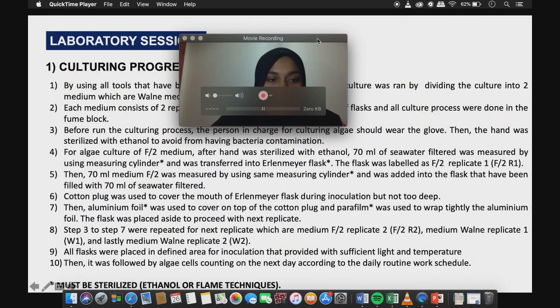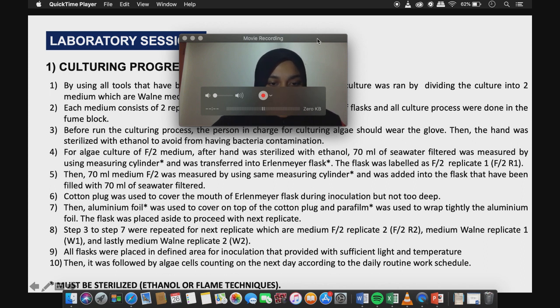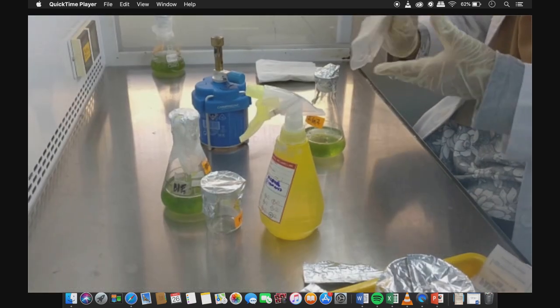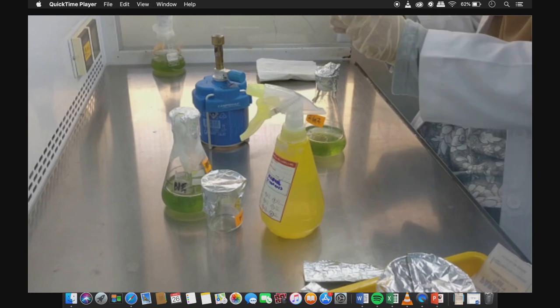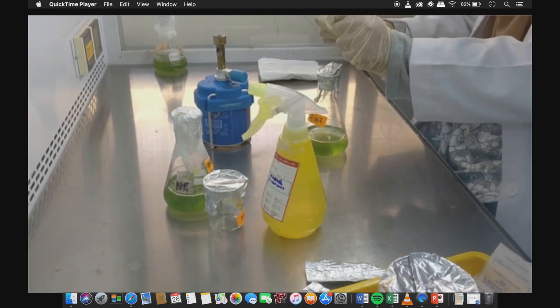Steps 3 to 7 were repeated for the next replicates: medium F2 replicate 2, medium W1 replicate 1, and medium W1 replicate 2. All flasks were placed in a defined area for incubation that provided sufficient light and temperature, followed by algae cell counting for the next day according to the daily routine work schedule.